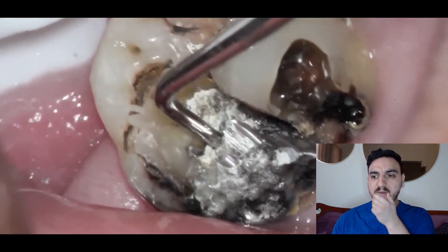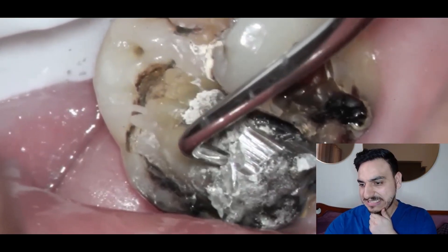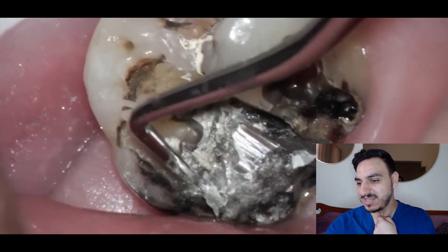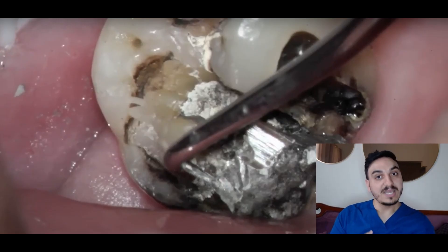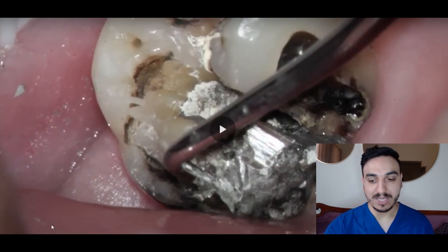The filling is moving — old filling with so much decay underneath it. What's up everyone, my name is Dr. Mo and I'm a dentist. A lot of people ask me: can silver fillings be replaced by composite or tooth-colored fillings? Let's watch this video of changing this old filling to a new and beautiful tooth-colored filling.